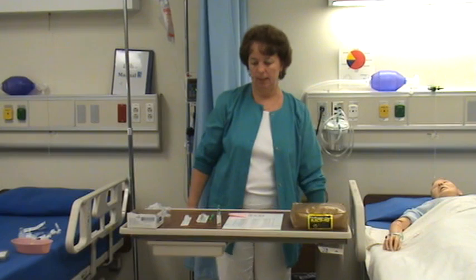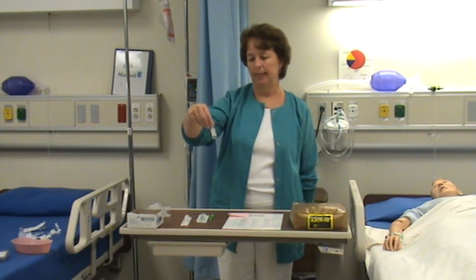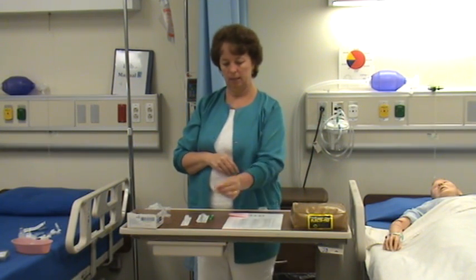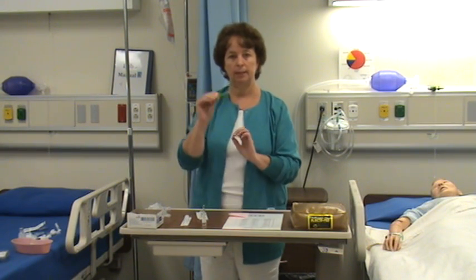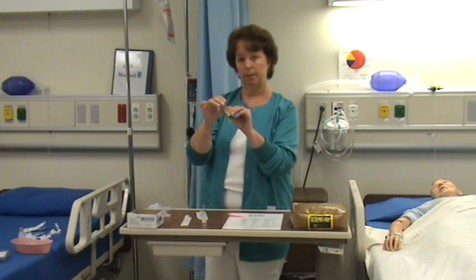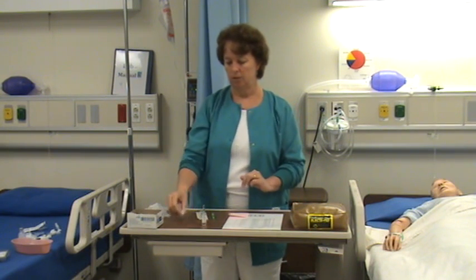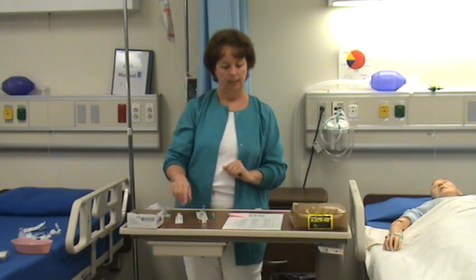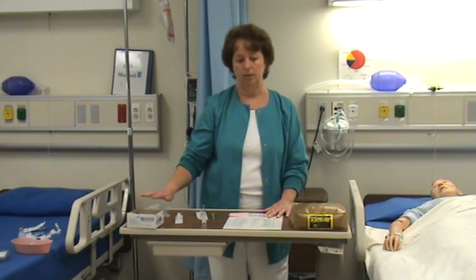I'm now going to demonstrate administering an intramuscular injection using medication withdrawn from an ampoule. I have my drug B and I also have my 3cc syringe. Because it's an ampoule, I'll need a filter needle — a large needle with a little filter at the end to filter out any glass that may fall into the liquid. I also have another needle to apply afterwards to inject into the patient. I have my medication sheet, clean gloves, and an alcohol swab.